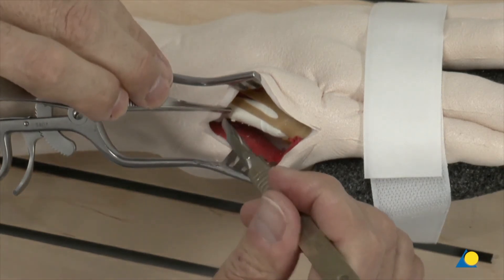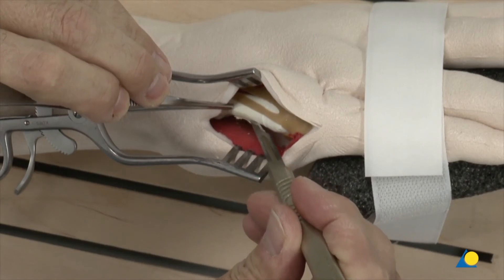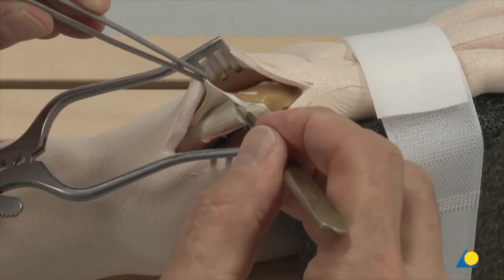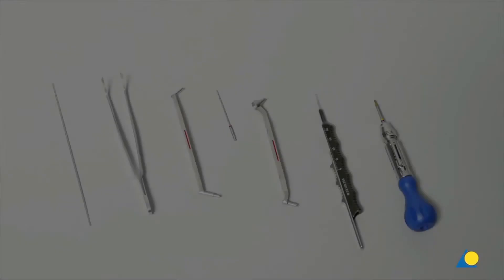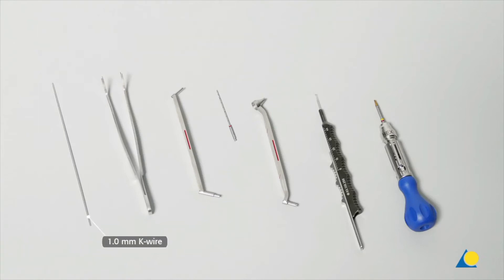The periosteum will be incised in order to approach the head and neck fracture. The required instruments for reduction and fixation are: the 1.0 mm K-wire, the plate holder, the 1.5-1.1 double drill guide, the 1.1 mm drill bit, the 1.1 mm variable angle double drill guide, the depth gauge, and the self-retaining star drive screwdriver.